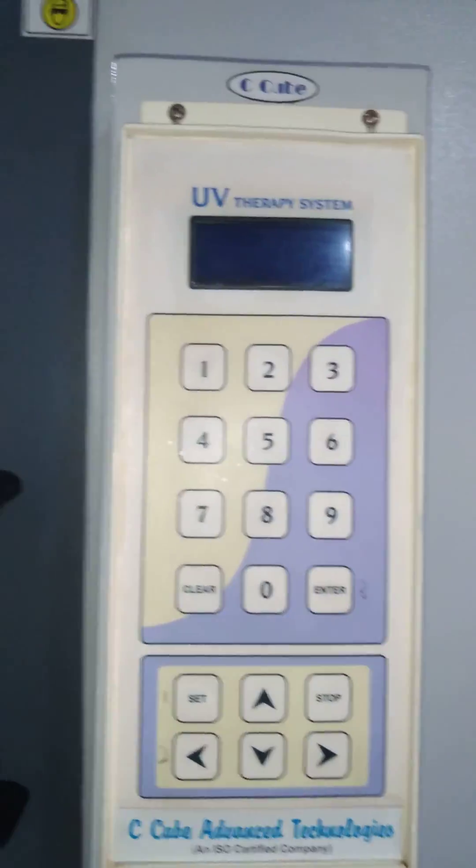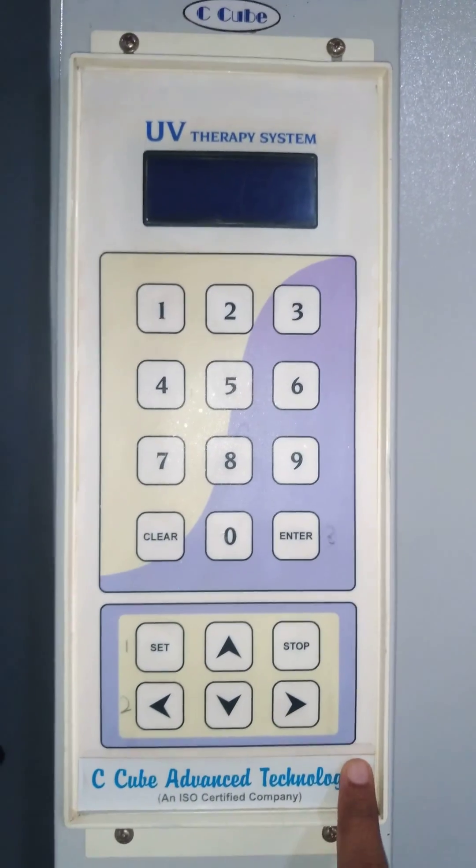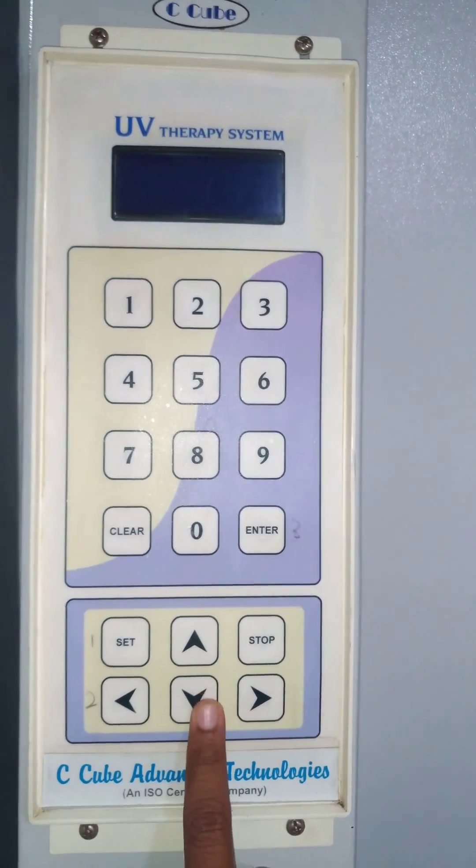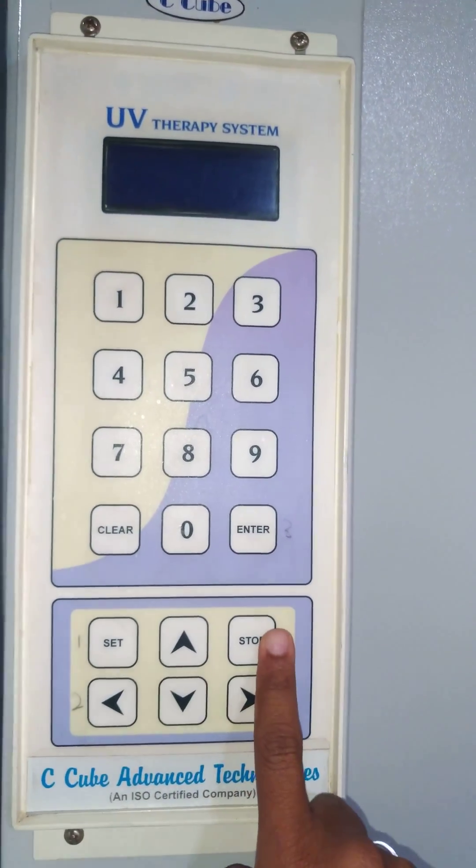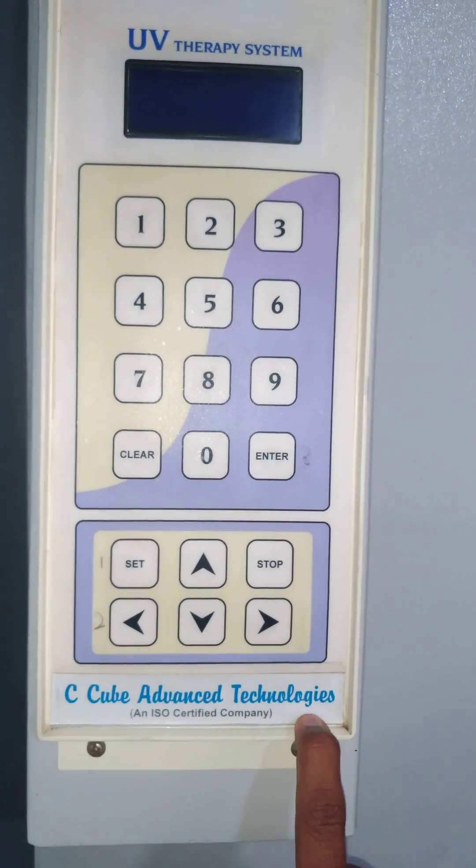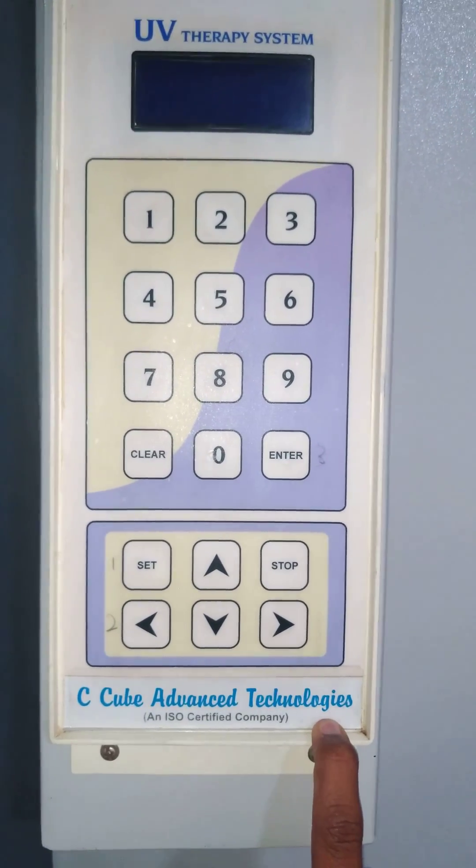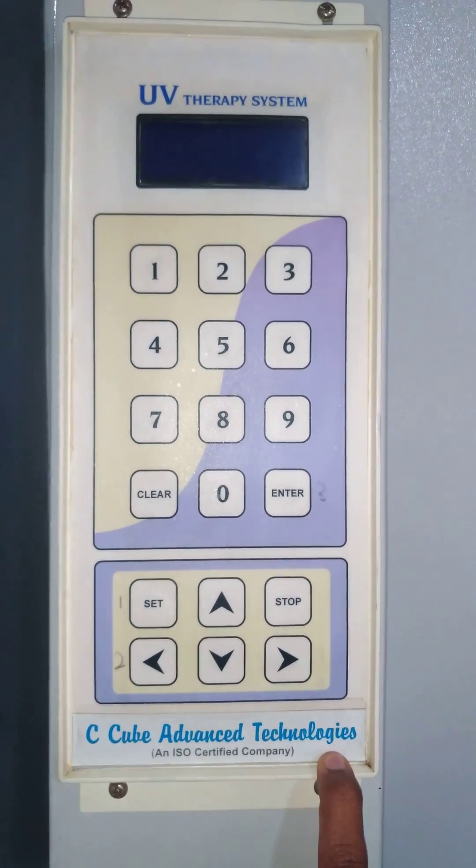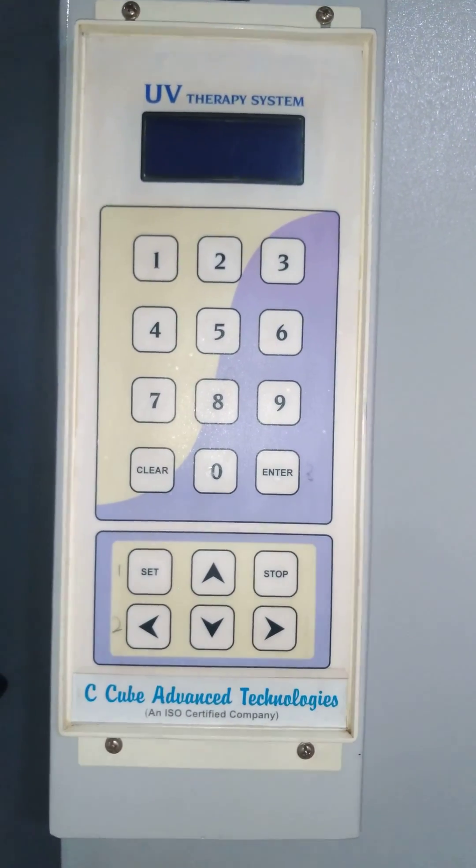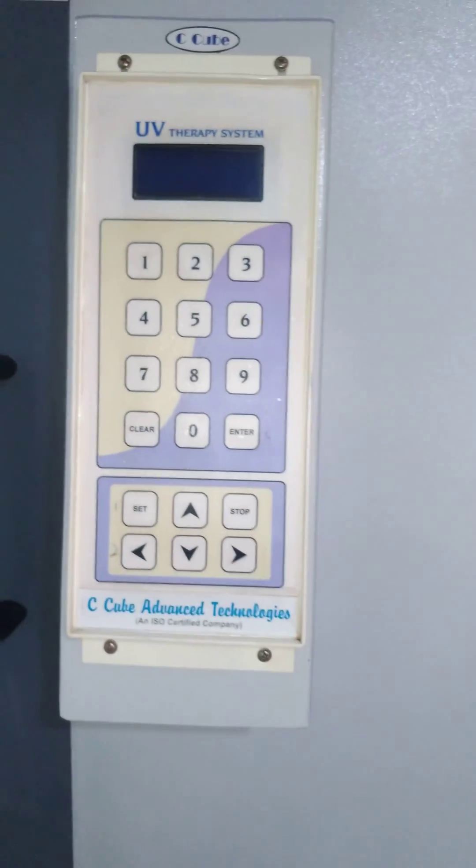This is the controller where you have a numeric keypad, a set button, and up and down buttons to increase or decrease the dosage. There is a stop button for any emergency stop from the operator's point of view. Now I will go to the controller operation.